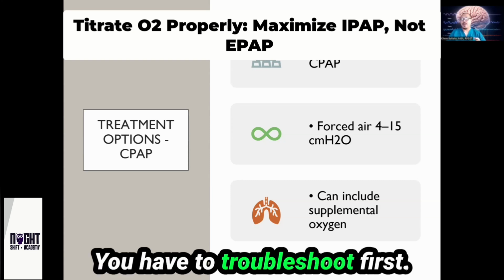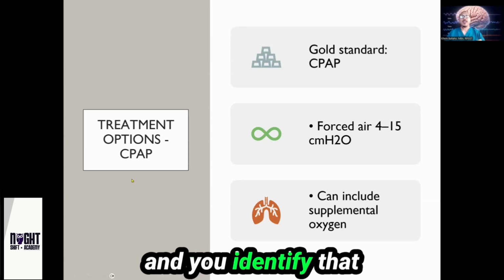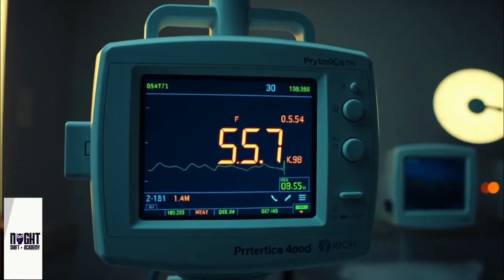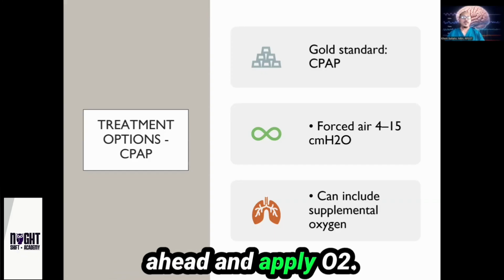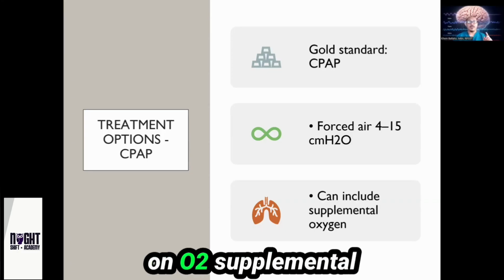Most sleep techs make this critical mistake, adding oxygen before fixing the real problem. What if I told you the right pressure adjustment could eliminate desaturations without O2? In this video, I'll show you exactly how to titrate smarter, not harder.